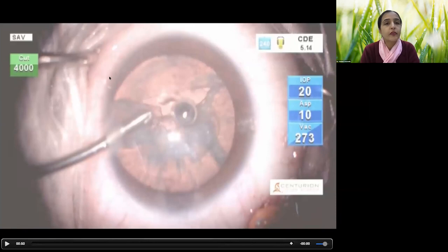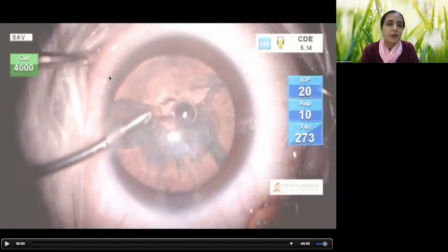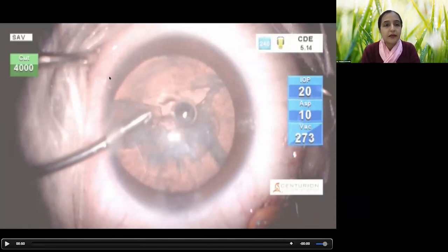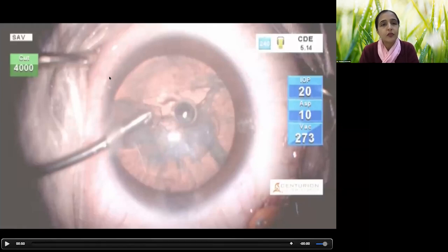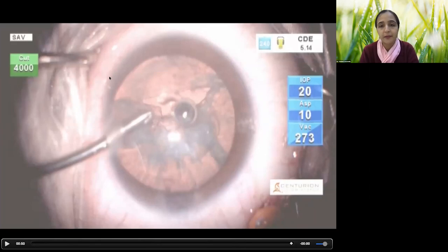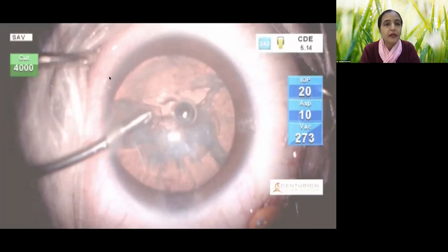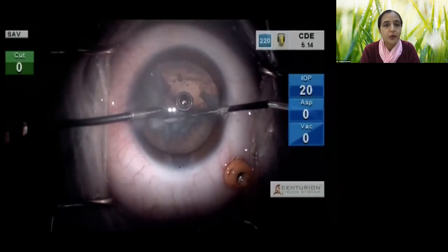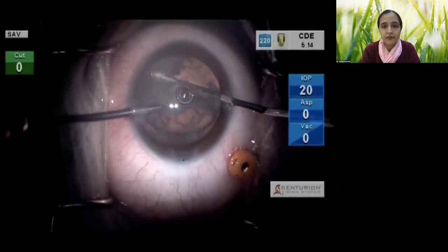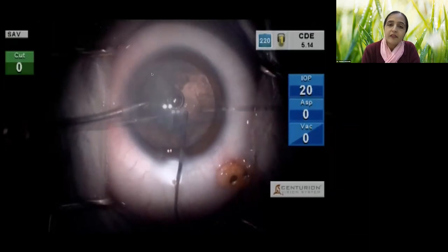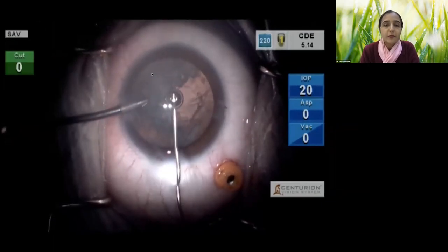Use the maximum cut rate possible — in this case 4000. Vacuum should be modest, about 350 to 400. Irrigation pressure and flow rate need to be low, because we don't want too much movement in the anterior or posterior segment. A high cut rate is essential — we want to cut, not aspirate, the vitreous attachments. Once vitrectomy is done, proceed with phaco as normal but very slowly, with IOP lowered to 20.